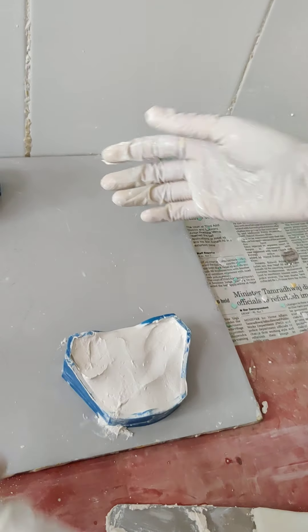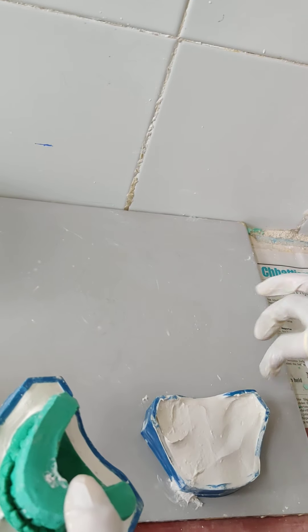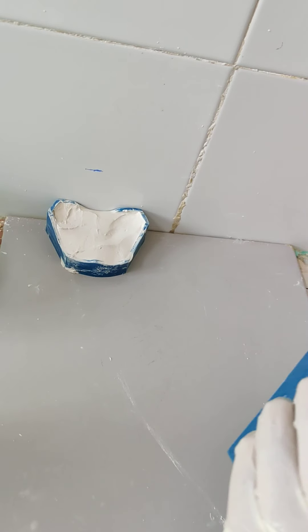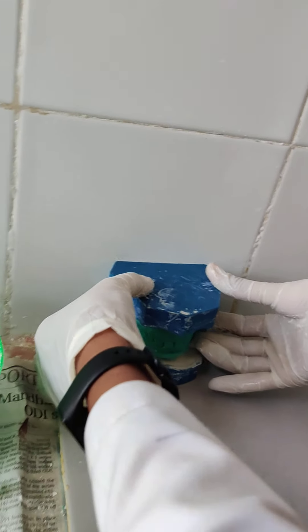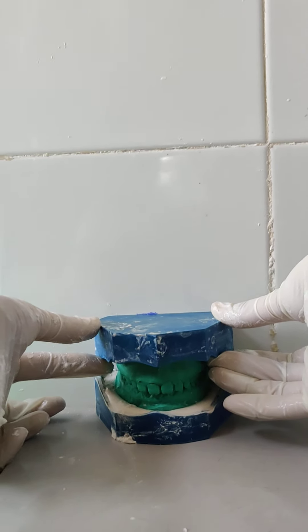Now the next step is the most important step: transferring the mandibular and maxillary cast in occlusion to the mandibular base former. Press it against the wall and ensure that the total height of the base is 7 mm.